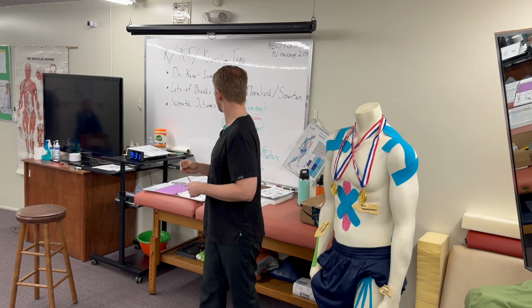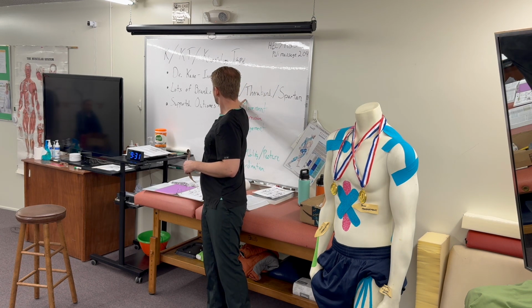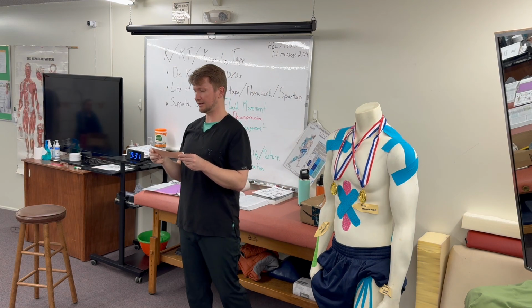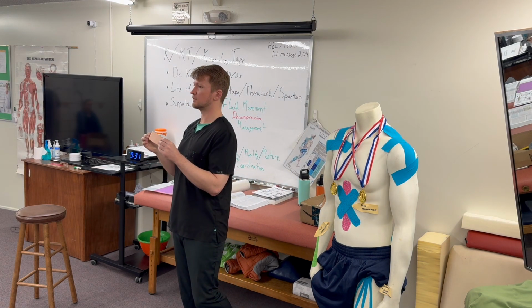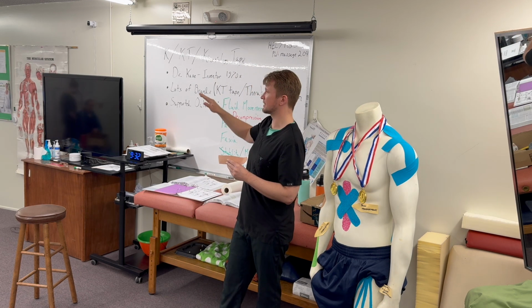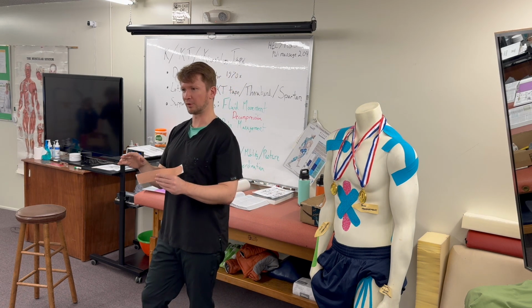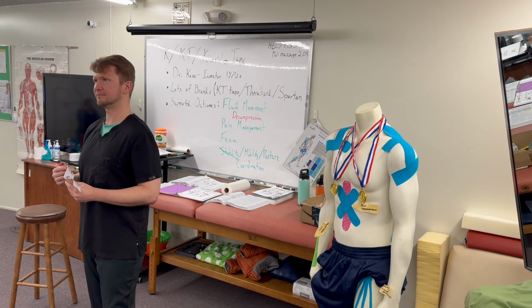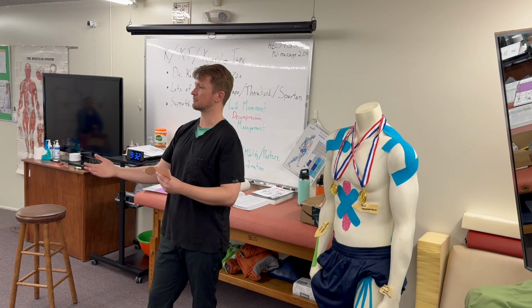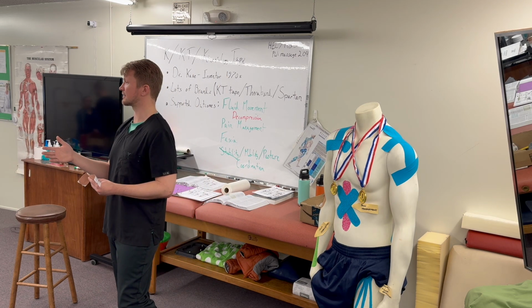Again, with the brands, there's not too big of a difference, I believe, price-wise here. I do like this for when you're learning. The adhesive quality with this one is pretty comparable to the KT Tape Classic. But the sport brand KT Tape, for me, was used much more often because of the sports setting, where somebody was more likely to be sweating and/or getting in and out of hydrotherapy-related stuff.